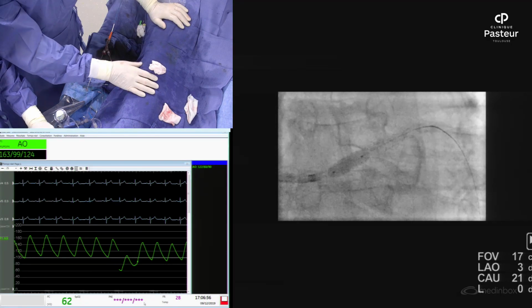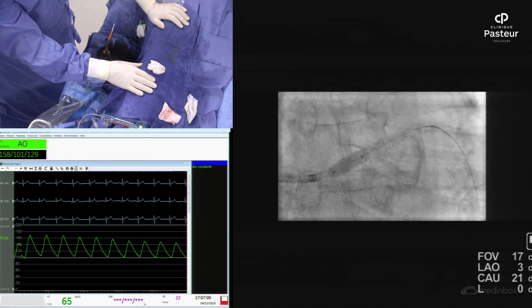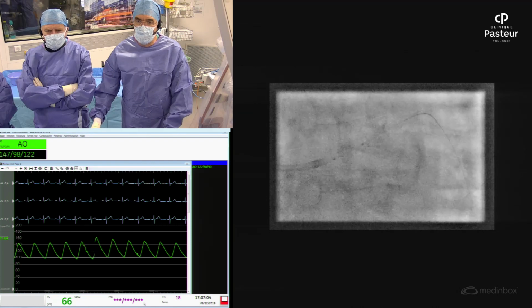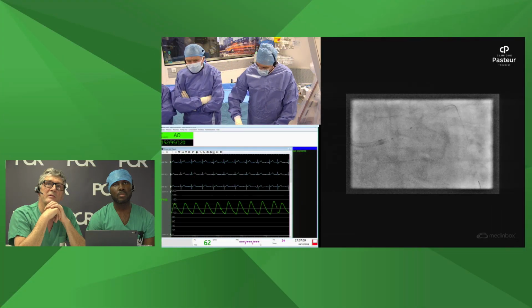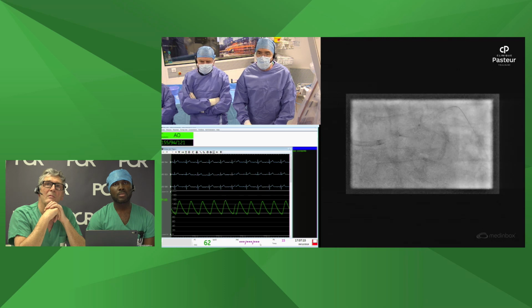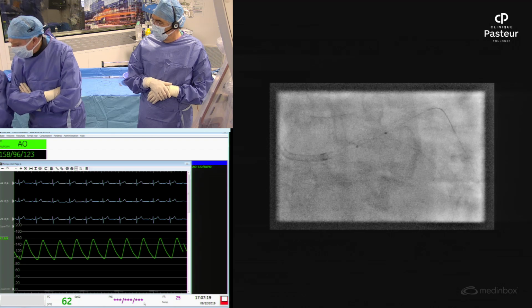So Jean, if you can do another stent view with the balloon a little bit more distal, just to show the scaffolding of the ostium, because I see that there is good scaffolding. I will advance the balloon a little bit, slowly. Yeah, this is perfect. Perfect.